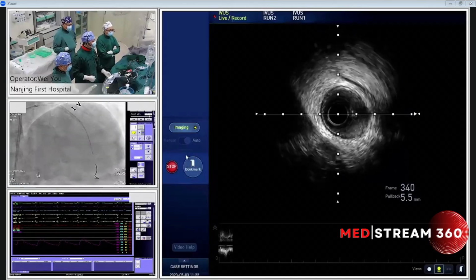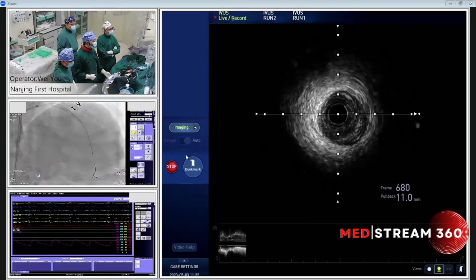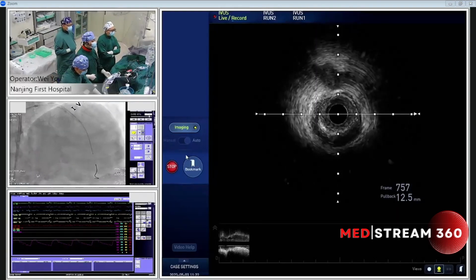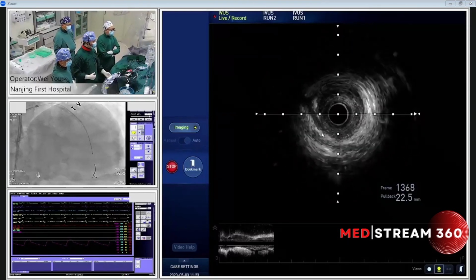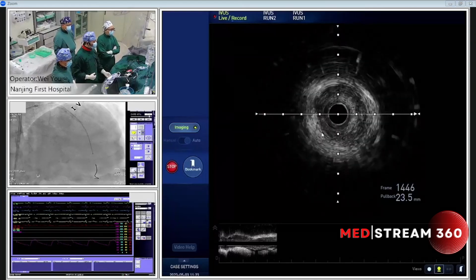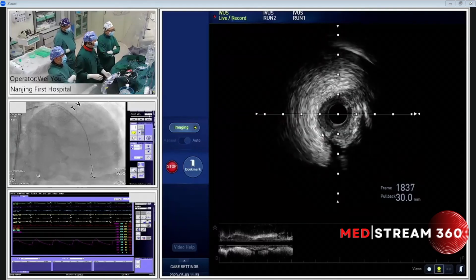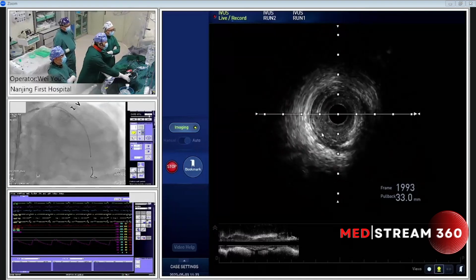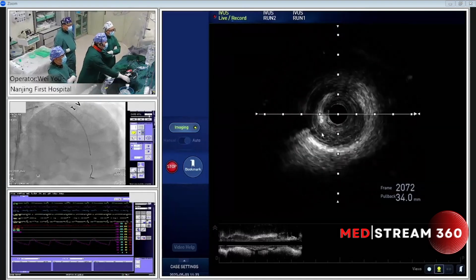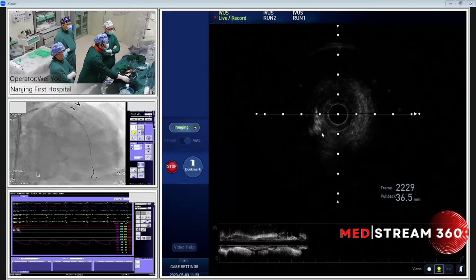Dr. Pan, you can interpret the IVUS image. This vessel is about 2.75. Here you can see eccentric plaque, I would say toward distal. Distal LAD here, the vessel is more than 3.0 millimeter. Very eccentric fibrous plaque, just at the mid LAD. This segment is a balloon dilatable lesion. Maybe NC balloon preparation is enough.